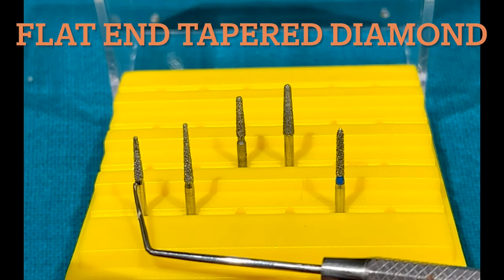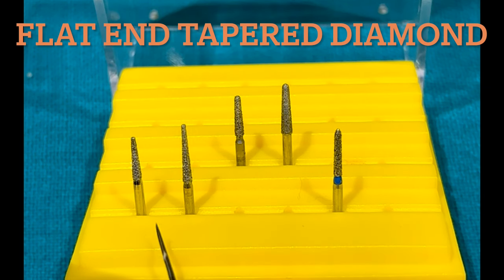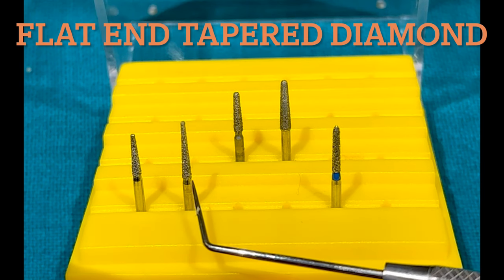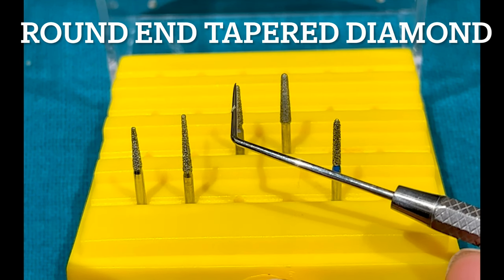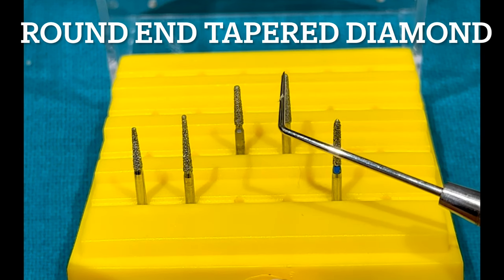This is a flat and tapered diamond — you can observe the sides are tapered and the edges flat. This is a round and tapered diamond — the sides are tapered and the edge is round. These are available in small and large sizes.